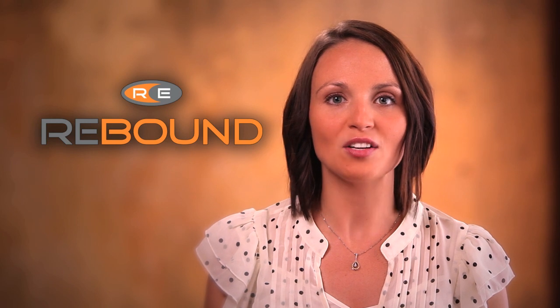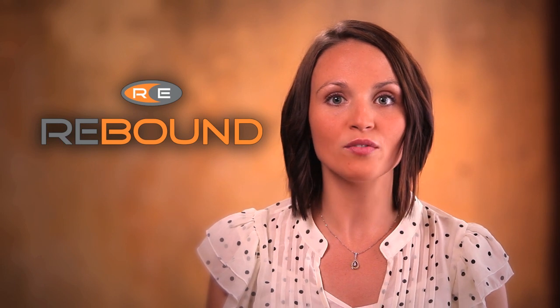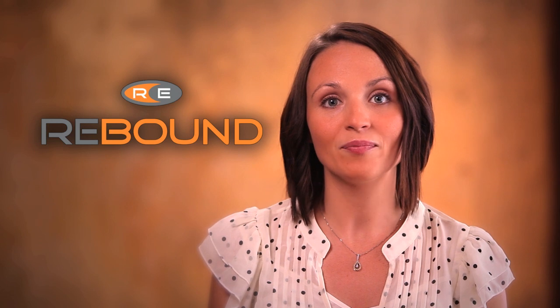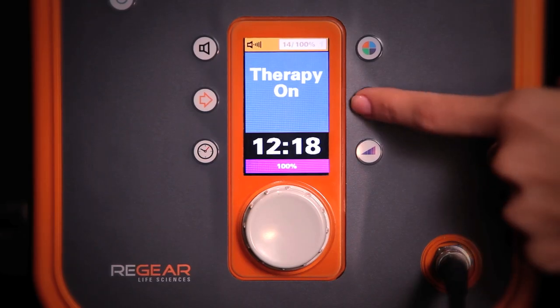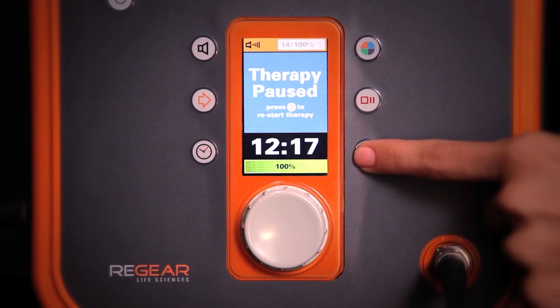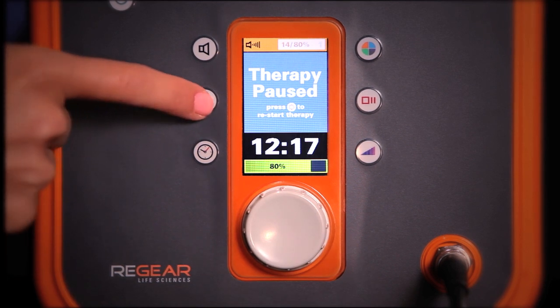Once therapy is started, your patient should start to feel the heat within the first 30 seconds. Some people will feel it almost right away, but this will vary depending upon the thickness of the layer between the therapy garment and skin, as well as the intensity level. The heat should always be gentle, comfortable, and soothing — like being in the sun. If at any point the patient feels it's too warm, just pause the treatment, press the intensity button, decrease the intensity by 20%, then press the continue button to resume.